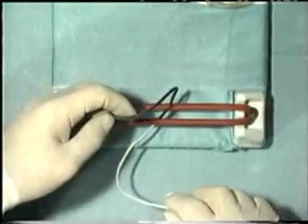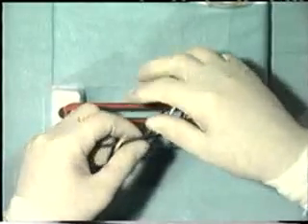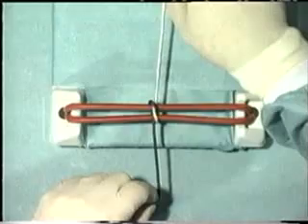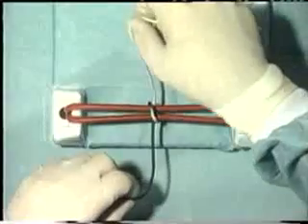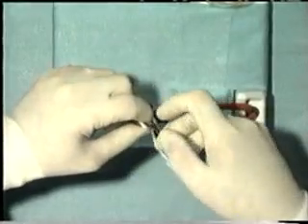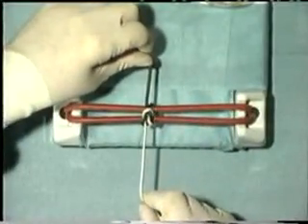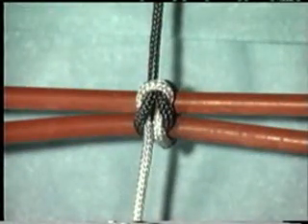We will now tie one in slow motion, demonstrating once again the features of tying a two-handed reef knot. Ensure that the threads end up at the opposite side of the jig to which they started, and snug down the throw securely. Then repeat the throw, coming back again, ensuring that the threads end up at the opposite side of the jig to which they started, to ensure that the knot lies correctly. Once again, the classic picture of a reef knot is seen.